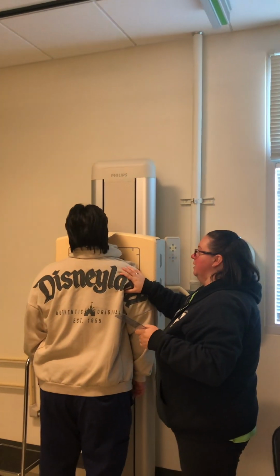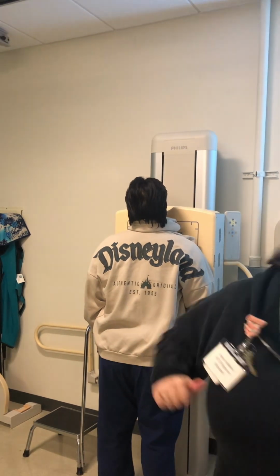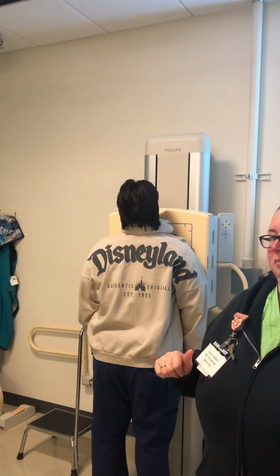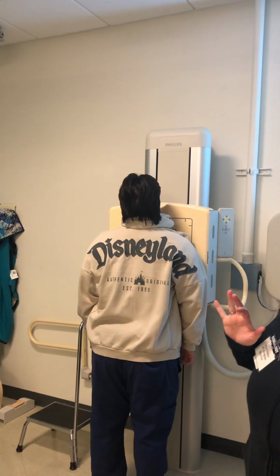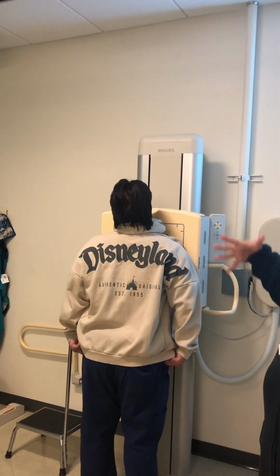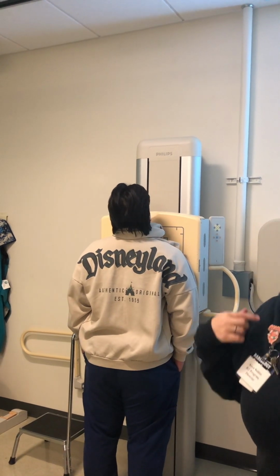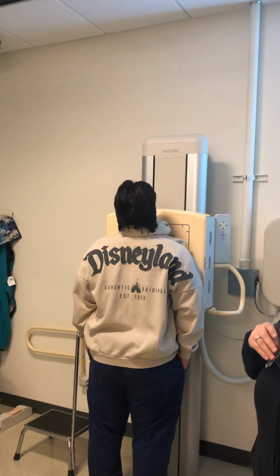Okay? So the point is not to get their right side to touch. That's not really going to help you in this case. Especially women who have breasts, there's going to be some OID there. If you get women's shoulders to touch, you will have rotated them too far.